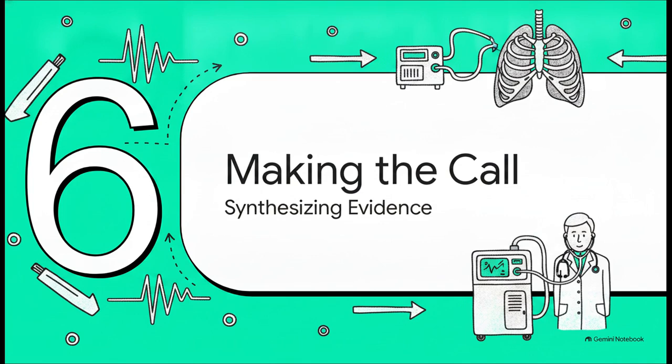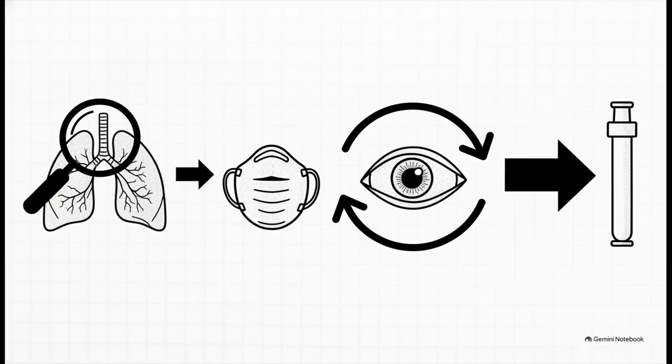So, how do we bring all of this together when it actually counts? Let's synthesize this physiological data and guideline reporting directly back to your bedside decision-making. Your primary goal is to identify the underlying cause of the respiratory failure immediately. If it's a COPD exacerbation or pulmonary edema, and the patient is conscious and cooperative, intervene early with NIV to save them from the risks of the tube. But remember, you must constantly reassess. Watch their work of breathing closely, check those ABGs, and if they are failing, escalate to invasive intubation without hesitation.